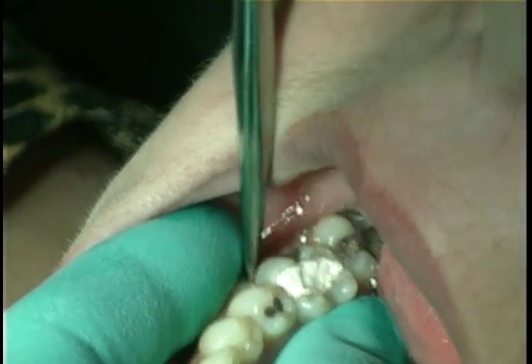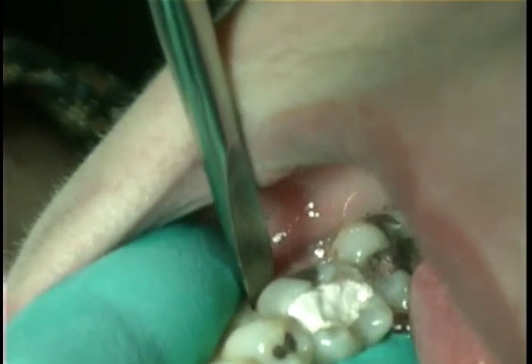The gingival fibers around the tooth are broken with a periosteal elevator.